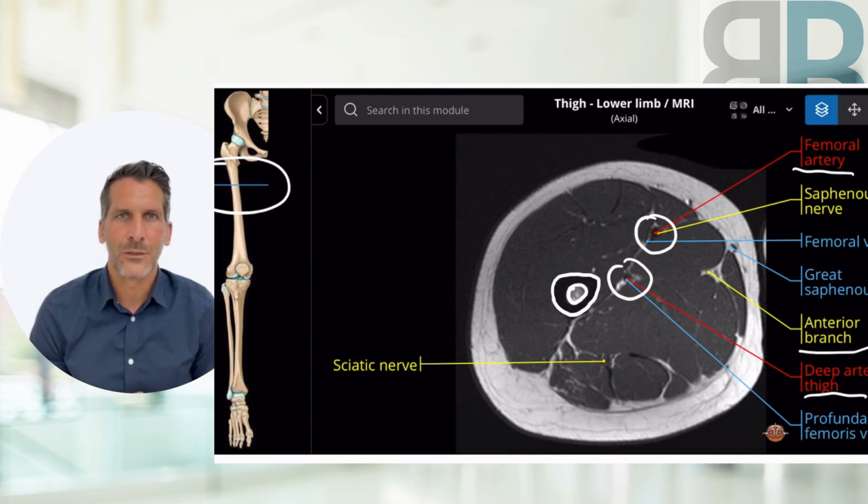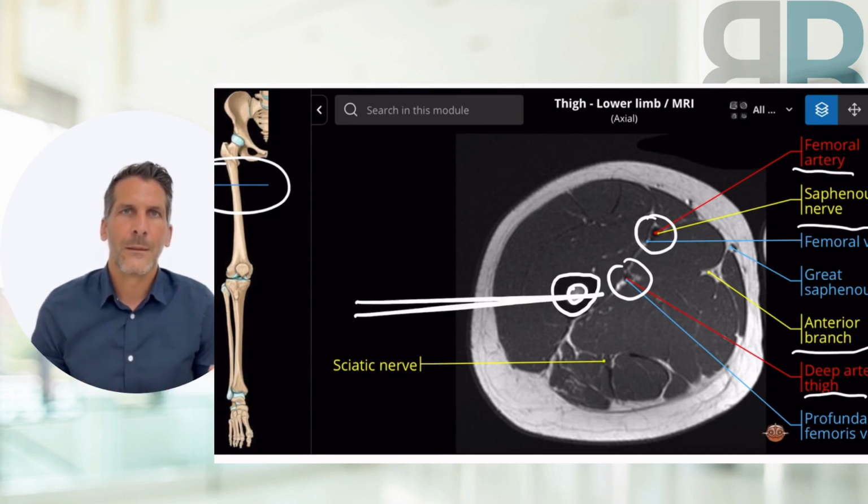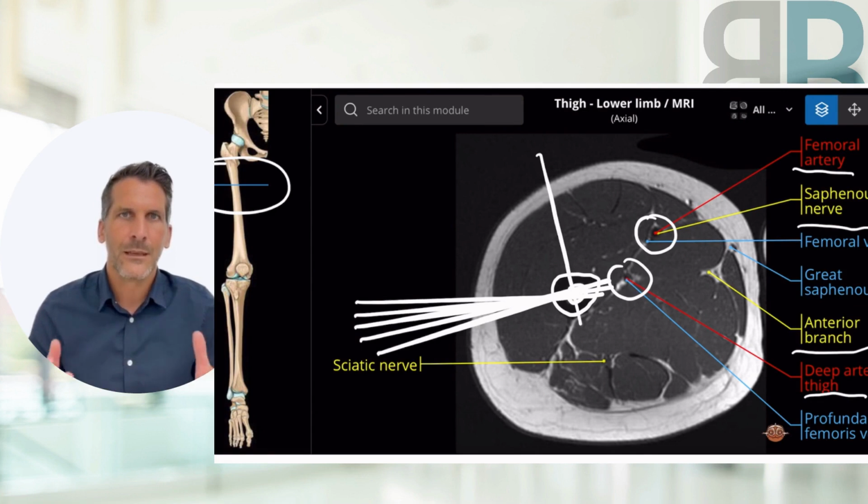The cutting is generally done through auxiliary incisions placed opposite each other to hit and weaken as many areas of the bone as possible with the drill. Subsequently, the remaining bone bridges are broken through with a hammer and chisel. You can see that one must penetrate large distances of soft tissue just to reach the bone. This is unavoidable, as the target structure is located centrally in the thigh.